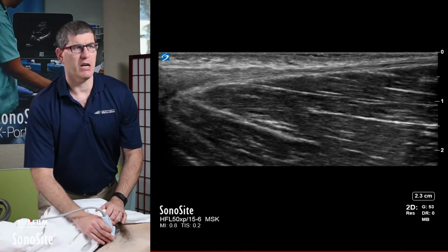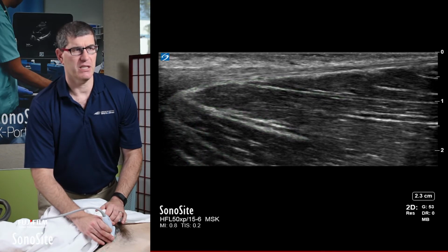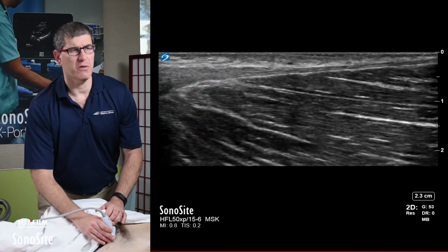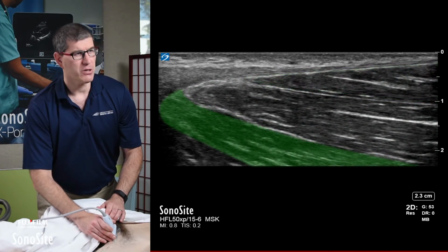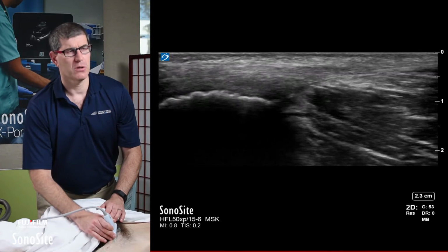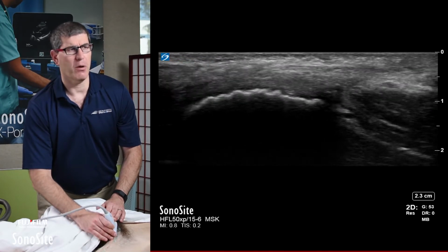So what we can see here is the tight fibrillar architecture of the adductor tendons, and depending on the plane, you can often see the different divisions of the adductor musculature between the adductor brevis, the adductor longus, and the adductor magnus. We're actually going to trace this all the way up to the pubic tubercle. Now we're looking at the left side of a male patient.